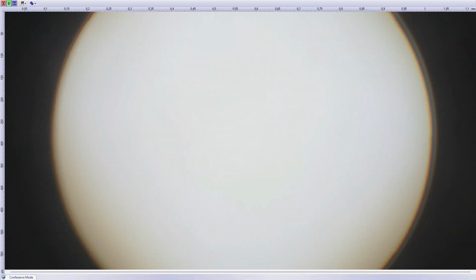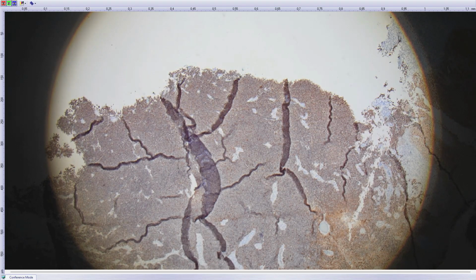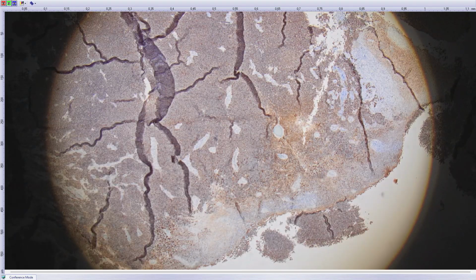Of course, this morphology can be present also in some round cell sarcomas, but that would typically be found in younger patients. It's not impossible to find round cell sarcoma in an old patient, of course. So actually the second differential would be a metastasis of neuroendocrine carcinoma from another location. Theoretically, it could be some hematological malignancy, but the morphology wasn't really looking like lymphocytes or lymphoid cells.